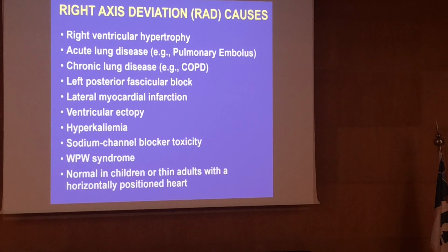Remember that right axis deviation can be normal in young people, so we don't worry. Left axis usually is not normal, but right axis can happen in young people. Okay, any questions? So we are okay?